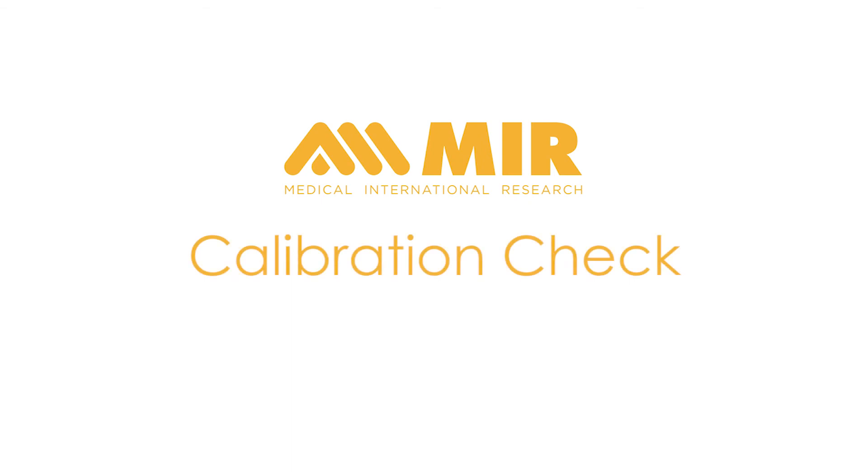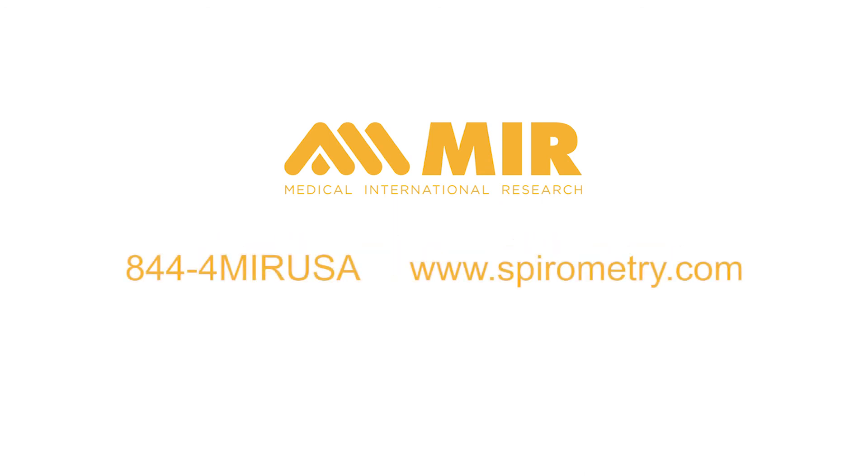This completes the procedure for doing a calibration check on an MIR SpiroLab Spirometer with a 3-liter syringe. Thank you for your interest in the MIR Spirometers. For more information, contact MIR at 844-4MIR-USA, or you may visit our website at www.spirometry.com.